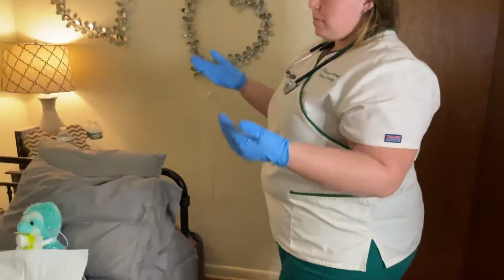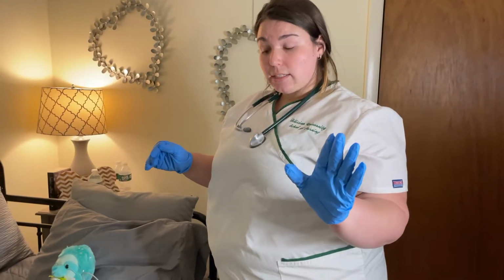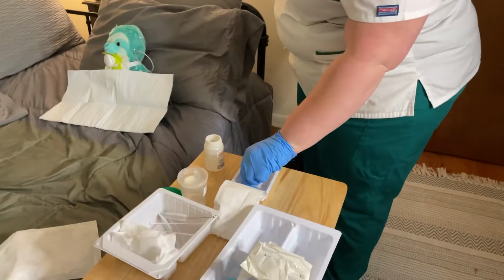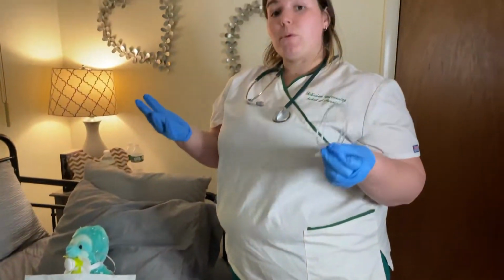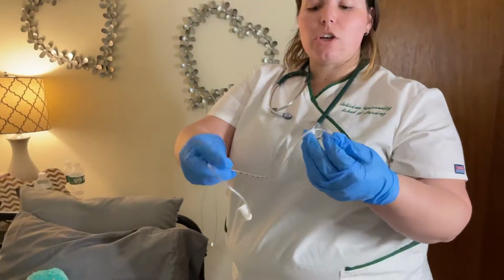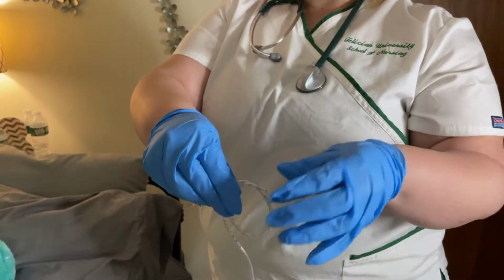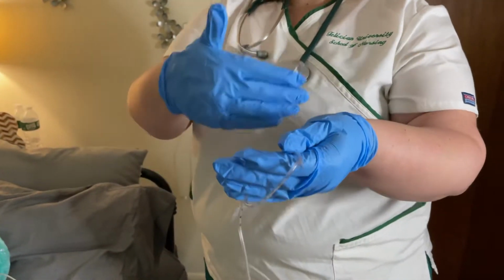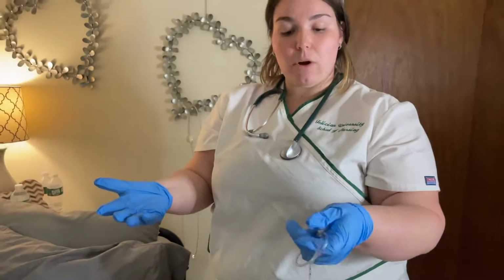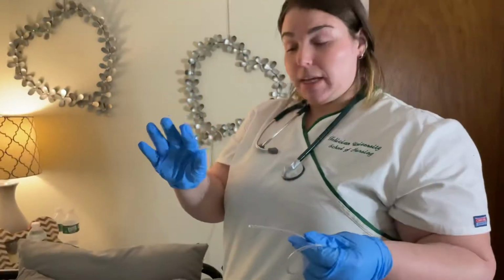So when performing my trach suction and care, this is going to be my clean hand and this is going to be my sterile hand. So I'm going to take my suction with my sterile hand. At this point, both my hands are sterile. I'm going to wrap the suction tubing around my fingers like this, making sure that nothing of the tubing hits my arm or any non-sterile part. And I'm going to now make this my clean hand.